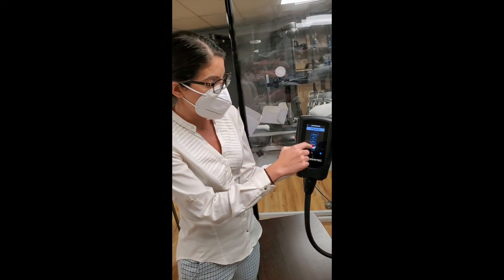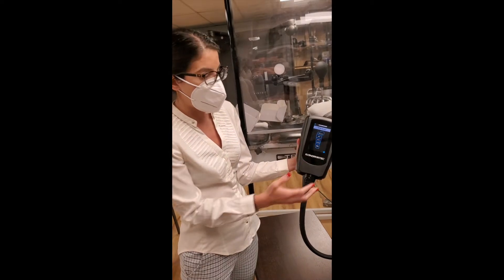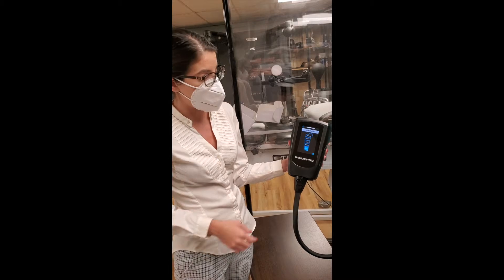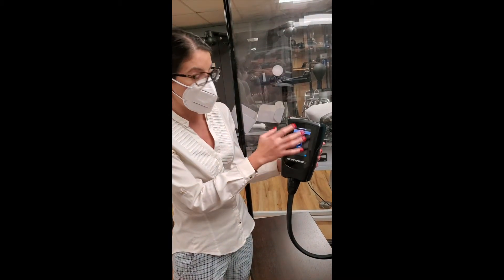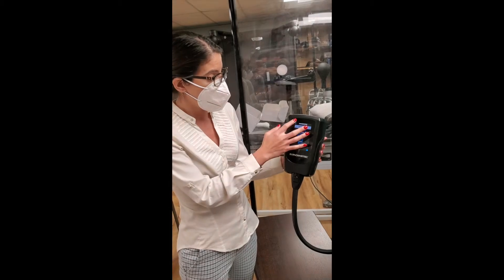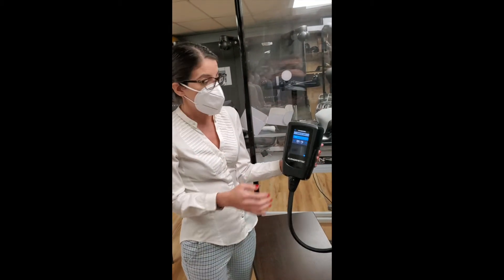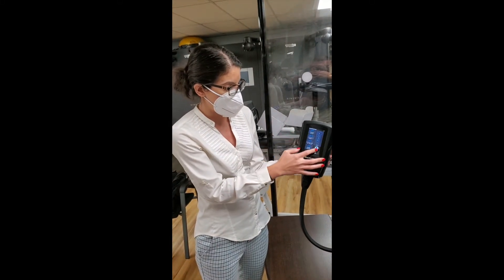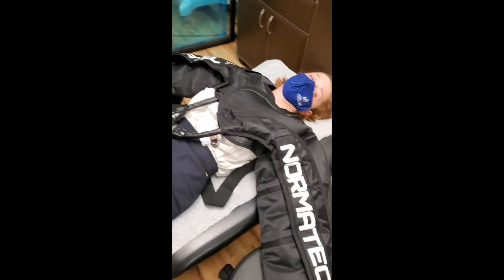With zone boost, you can pick the area where you want to focus. If they have a lot of inflammation in their hand or wrist I may zone boost that area, or if there's inflammation in the elbow or forearm — it depends on what you want to address. For time, you can set it from 10 minutes up. I'm going to do 10 minutes today with Charlotte, then you press start.